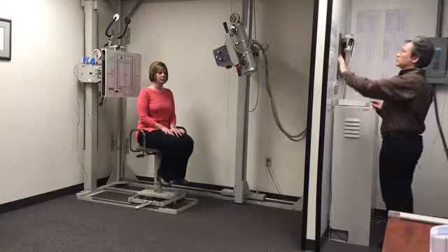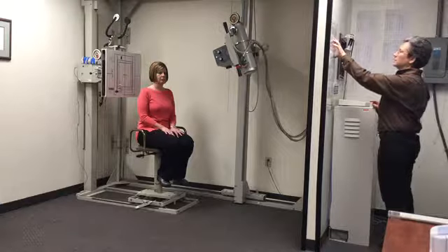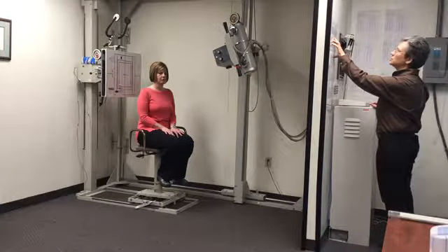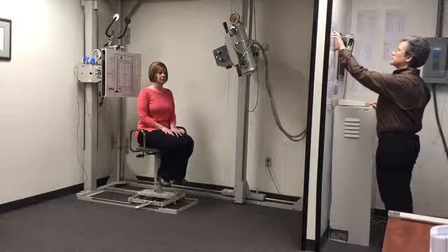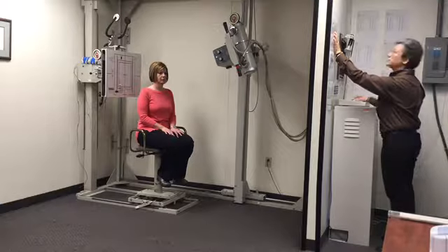And if there is no chart for a given specialty image, the focal film distance of that image determines which chart you use. So for this image, the A to P open mouth is the go-to chart for the most of our specialty images. So we're going to use the APOM chart and locate the 10 centimeter measurement. And we're going to set our KV at 66.